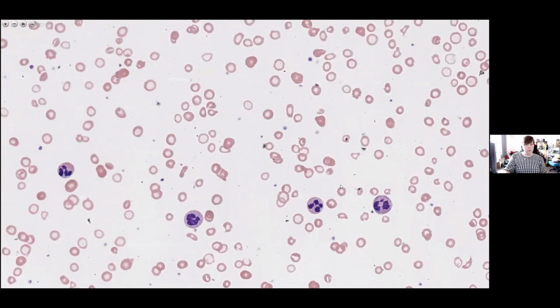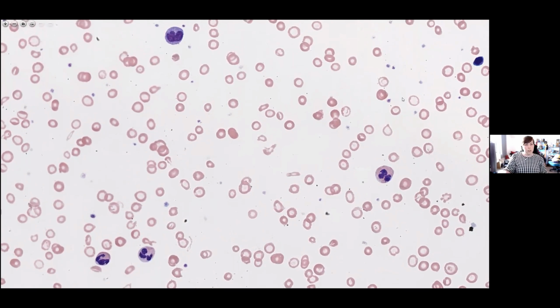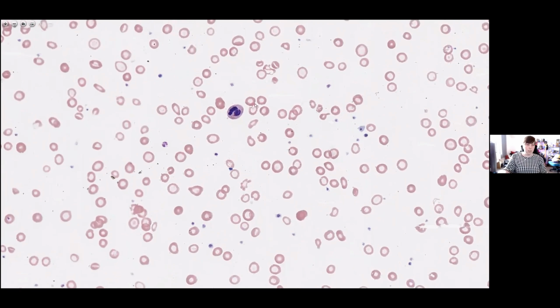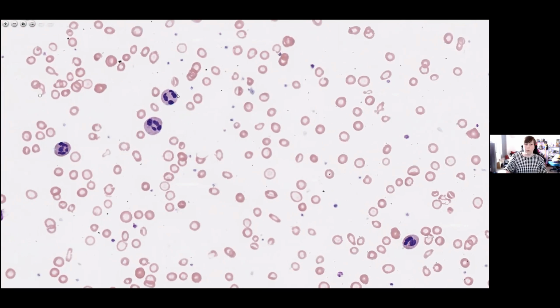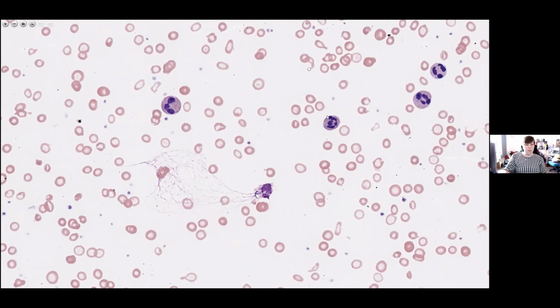And I think for the red cells, that's the majority of the changes that we can see there. Looking briefly at the white cells, the white cell count as a whole looks normal. It's in the normal range. And the neutrophils, to me, look pretty happy and mature. I wouldn't say that there's anything too abnormal. There are a few neutrophils which have 5 lobes.